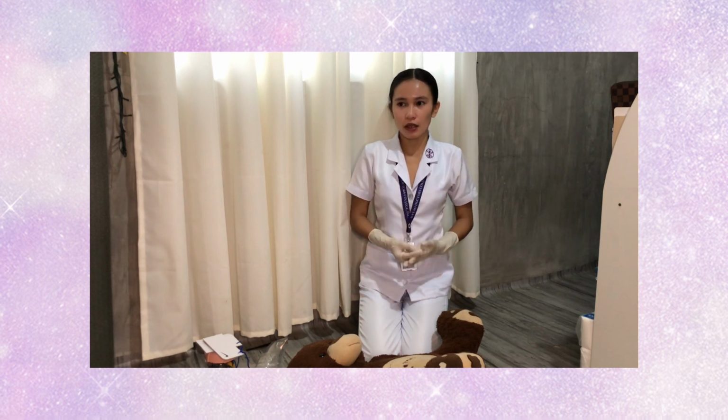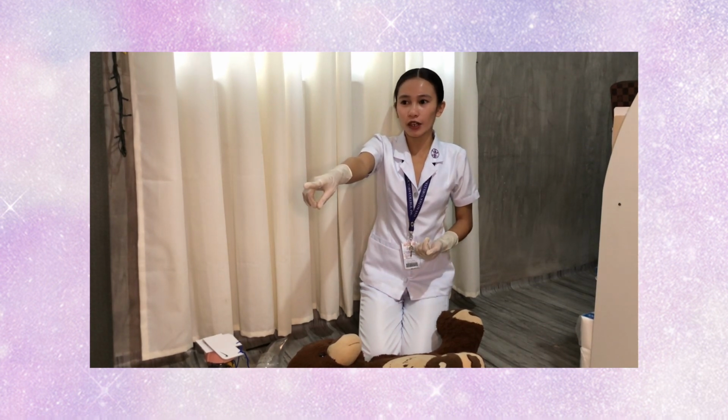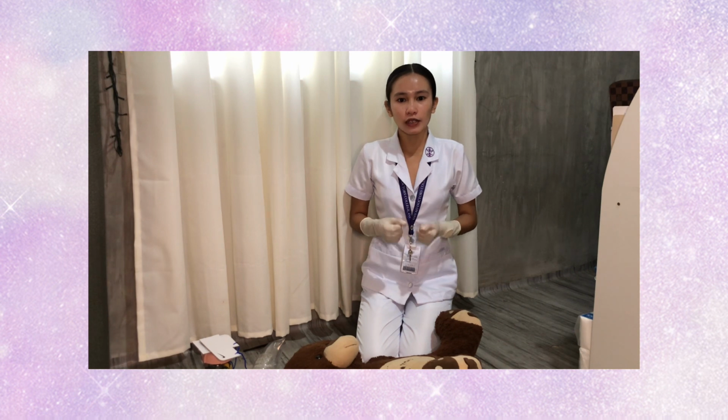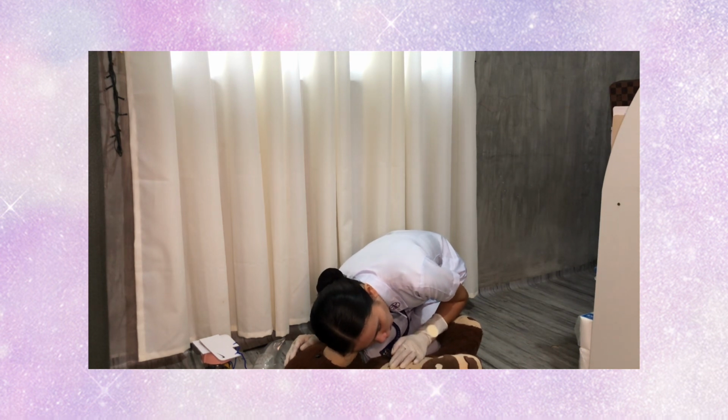emergency response system. So sir, in the black shirt, please call 911 immediately. We have a patient here and need immediate help. After doing that, I am going to check again the breathing and the pulse of the victim, and we also need to check the mouth to see if there is any obstruction of the airway. 1001, 1002, 1003, 1004, 1005, 1006, 1007, 1008, 1009, 1010.